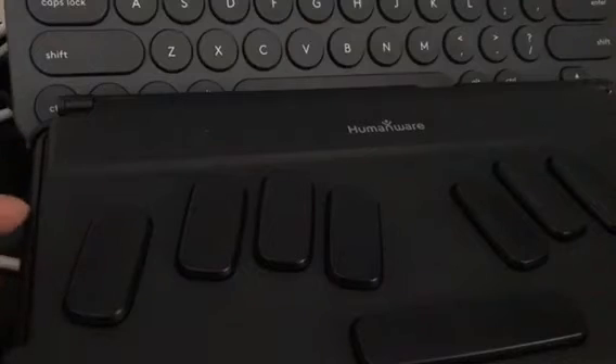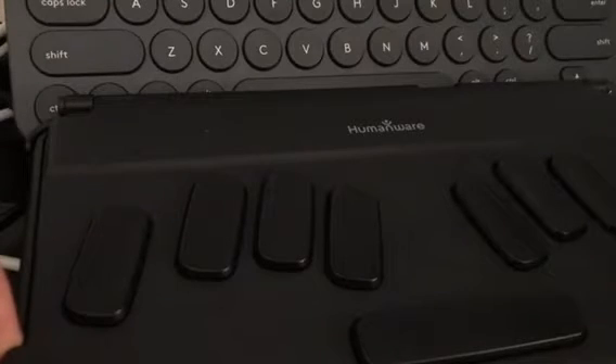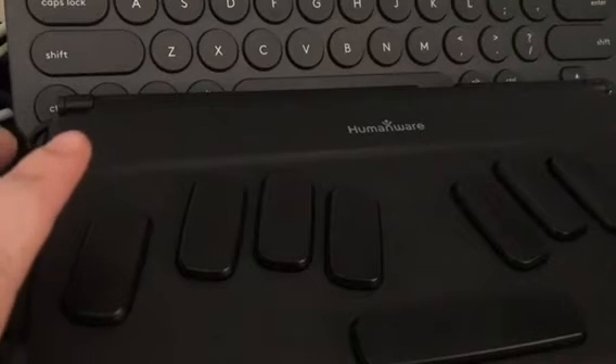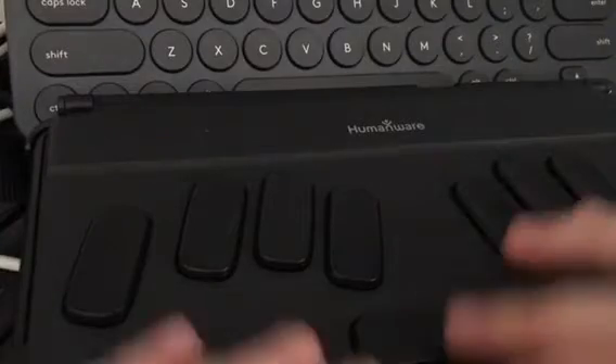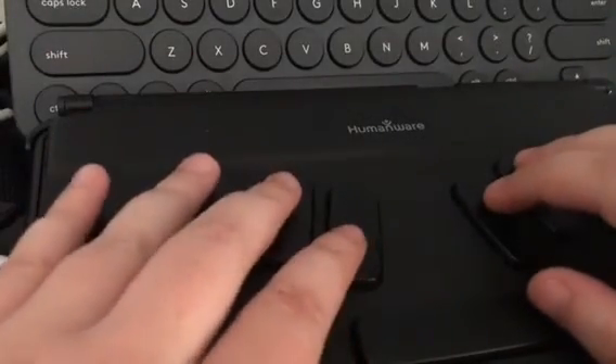Hello again internet, this is CatTiger here, also known as Blind Cat Blues. Today I've got a quick video for you guys on how to pair a Bluetooth keyboard with the BrailleNote Touch. I find I'm still a faster QWERTY typist than I am in Braille, so sometimes I prefer to have that option. I'm on the home screen now.